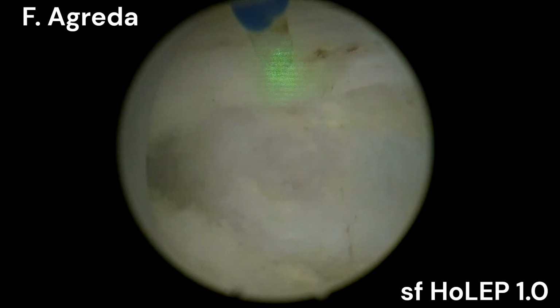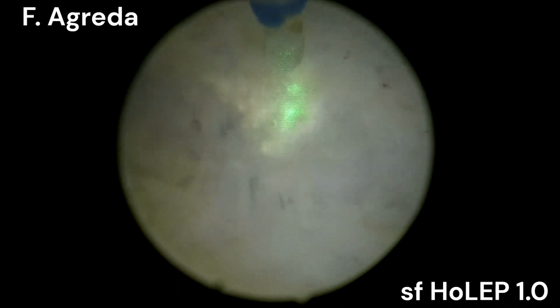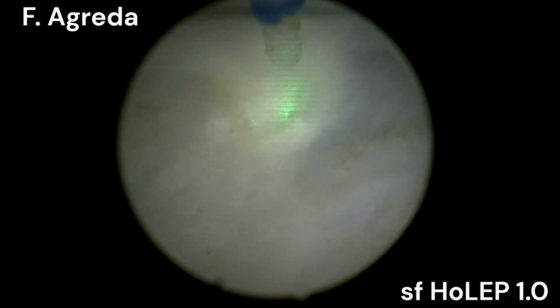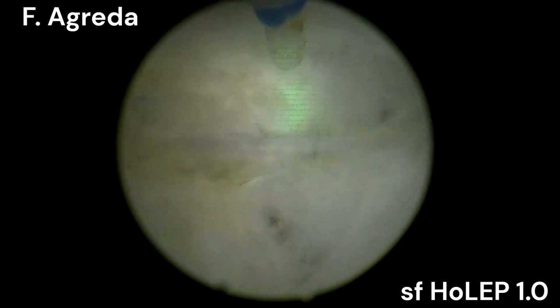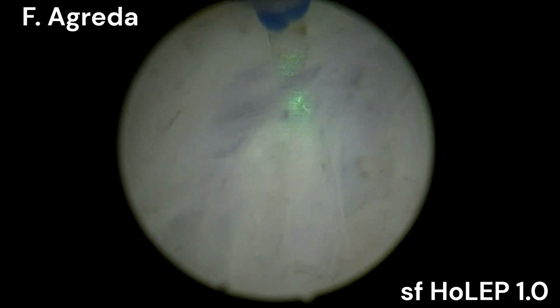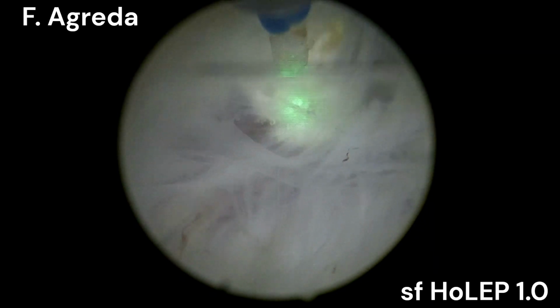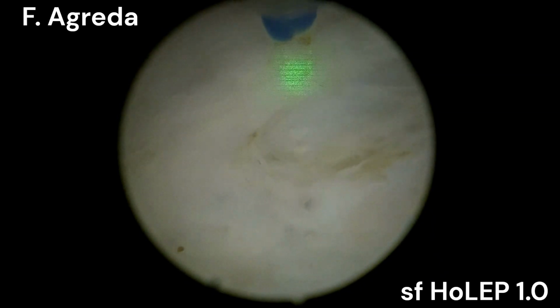You have to go in a very controlled manner, keeping in mind that you have to go to the trigono, and the direction of your progress cannot be horizontal or parallel to the ground. You have to go a little bit in the direction of the patient's belly button, if you can say that. You have to go in an upwards direction, not in a parallel direction, as you can see here.